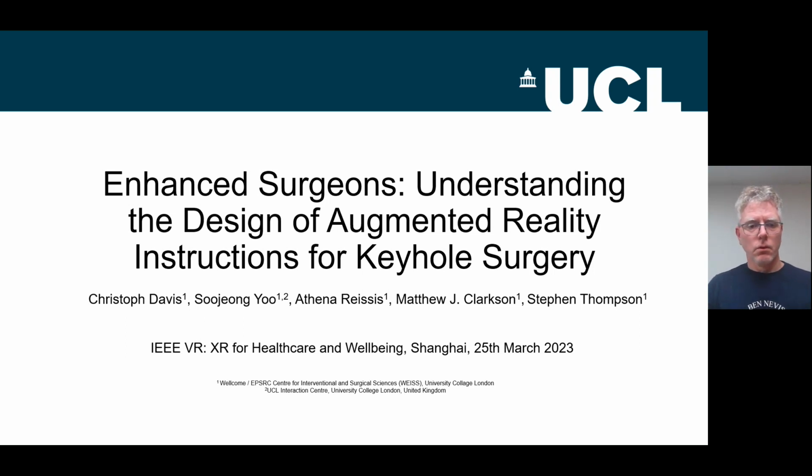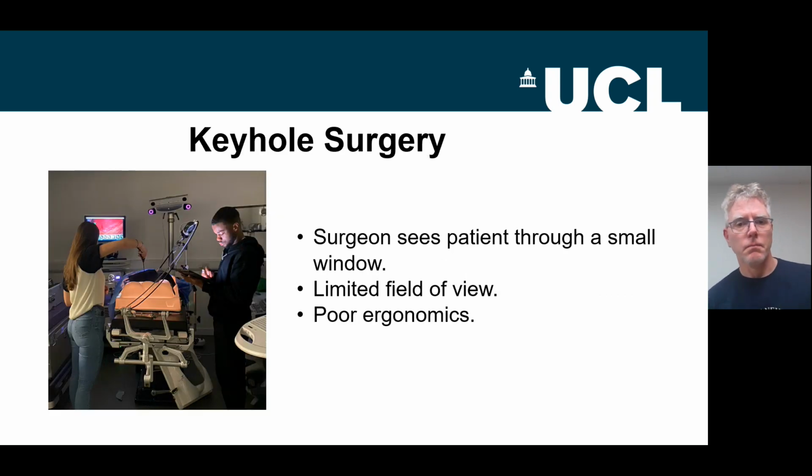So let's talk about keyhole surgery. Brief introduction for those who aren't familiar. Keyhole surgery is minimally invasive surgery, and so instead of cutting the patient open and operating directly, we operate using cameras and pivoted tools. There's a picture here of our experimental setup, so this is obviously not a clinical example, but this is what we had down in our lab.